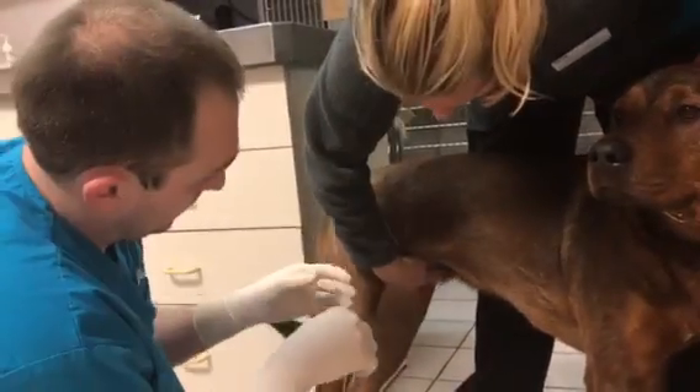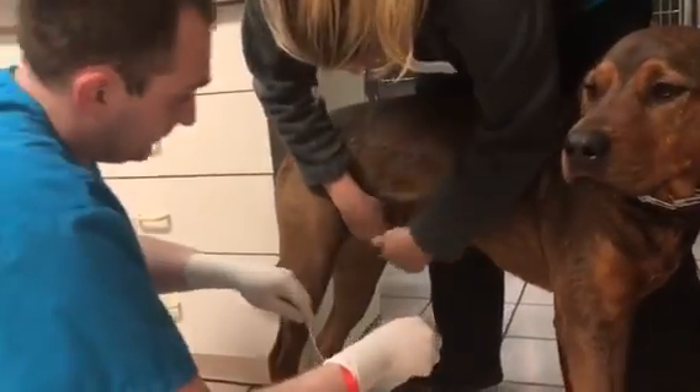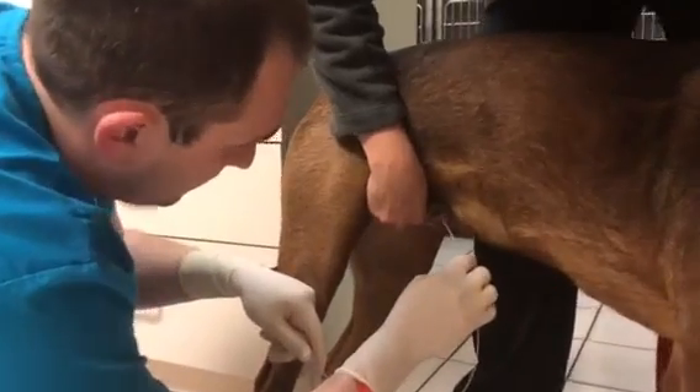I'm going to have her extrude the penis for me, so I'll be able to place it. I'll just take the tip and feed it through the urethra.